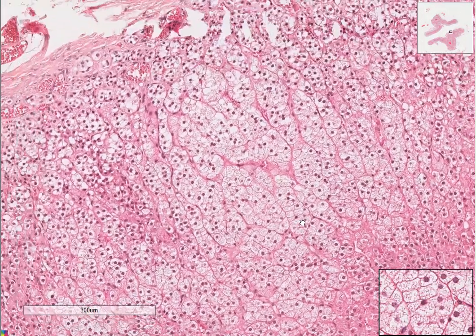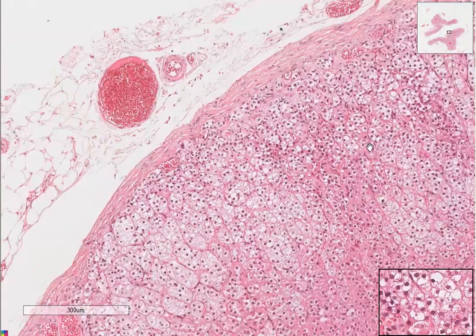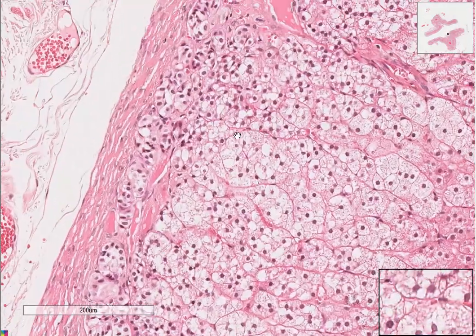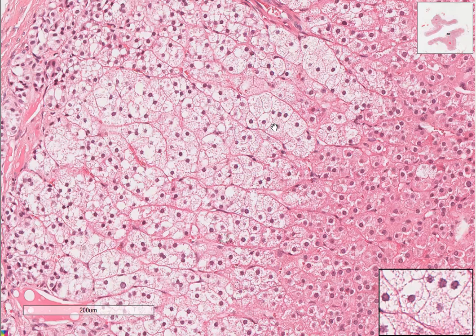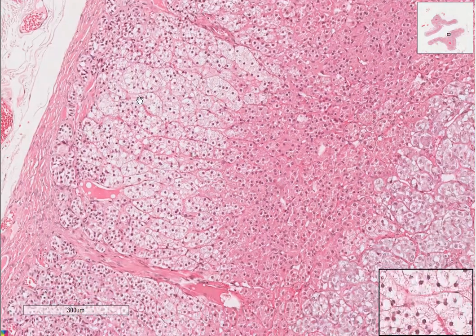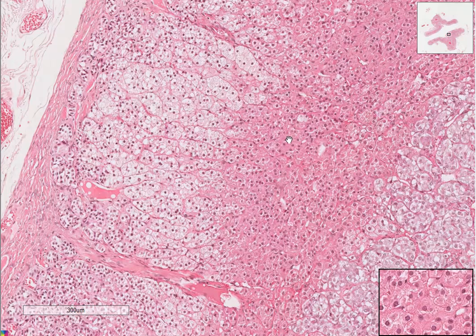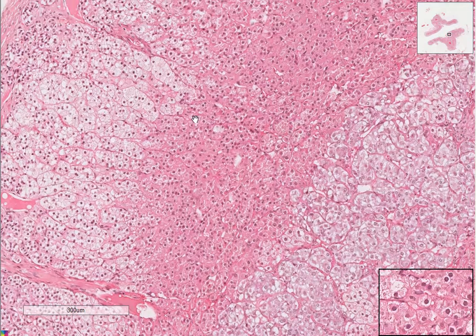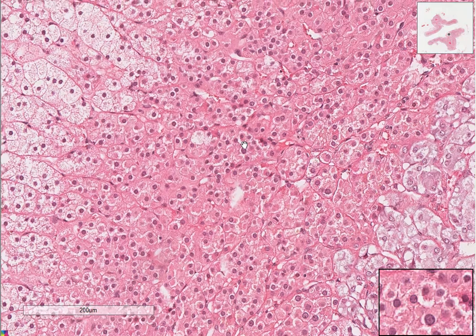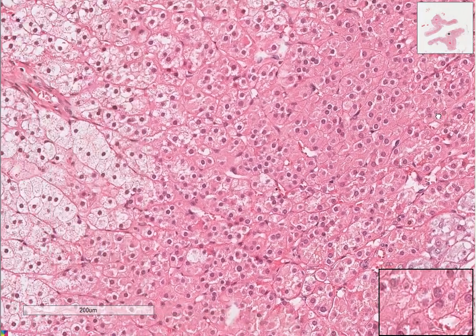So if you remember superficially, the zona glomerulosa, which are more like glomeruloids, you can see more sections, more areas here. Glomeruloids, then here they become in a fascicular arrangement. And remember, it's salt, sugar, sex, or the deeper you go, the sweeter, as other people like to put it. And then deep to the zona fasciculata is the zona reticularis. It's more reticulated, and you can see it's much more eosinophilic. This is where sex hormones are secreted.